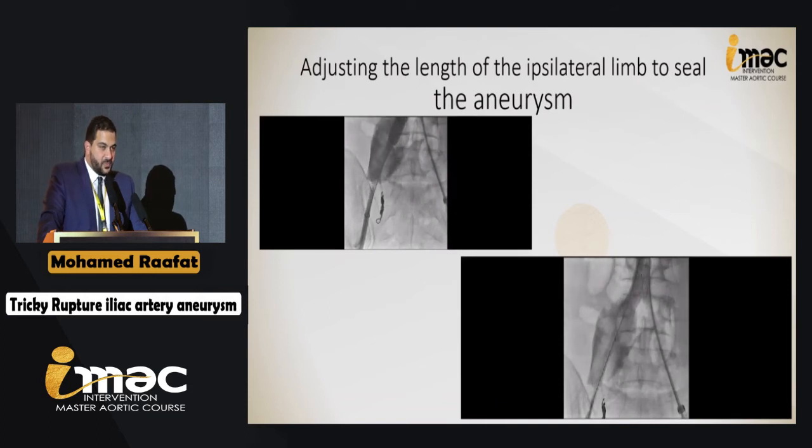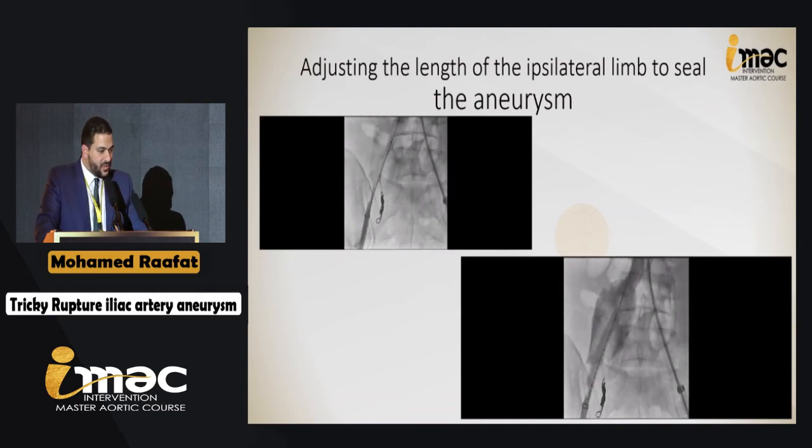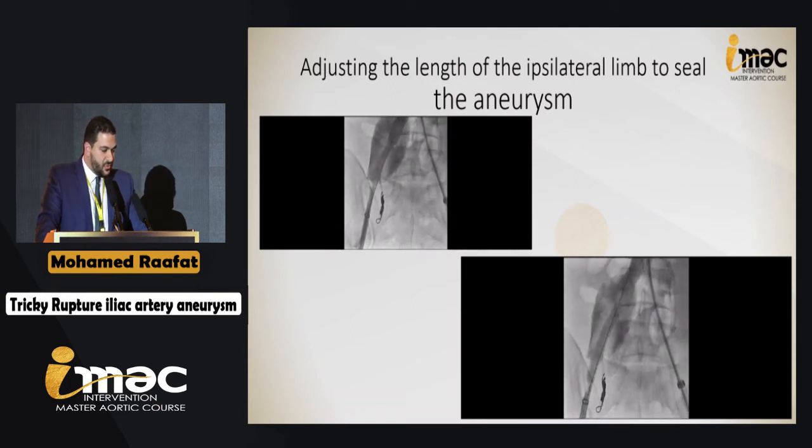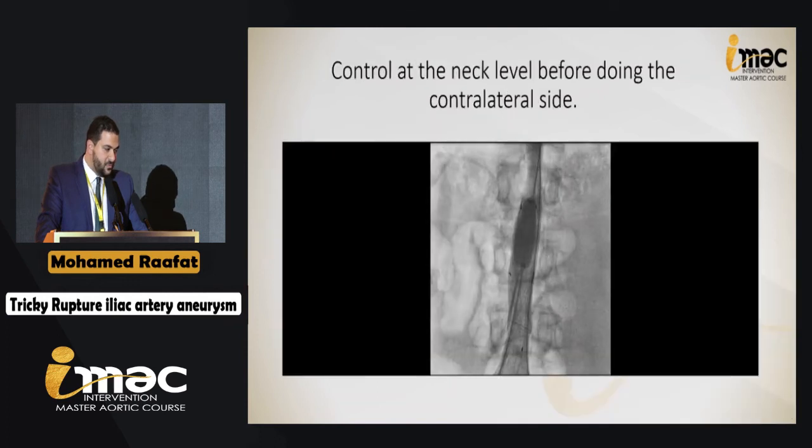Now, the device was placed ipsilaterally from the right side, and I had to place an extension limb, of course, on the right side, just to go from where the device was placed to 1 centimeter beyond the origin of the internal iliac artery.